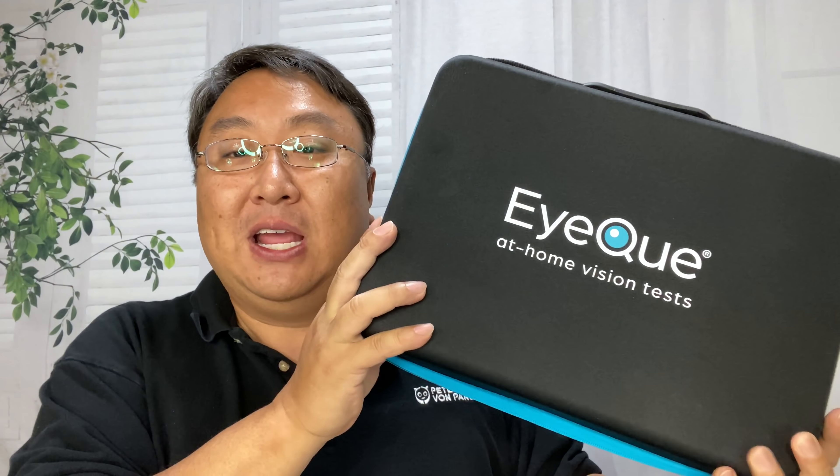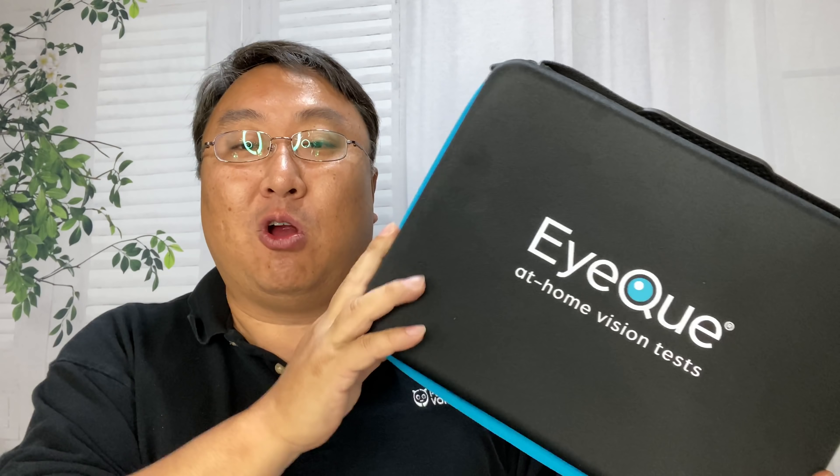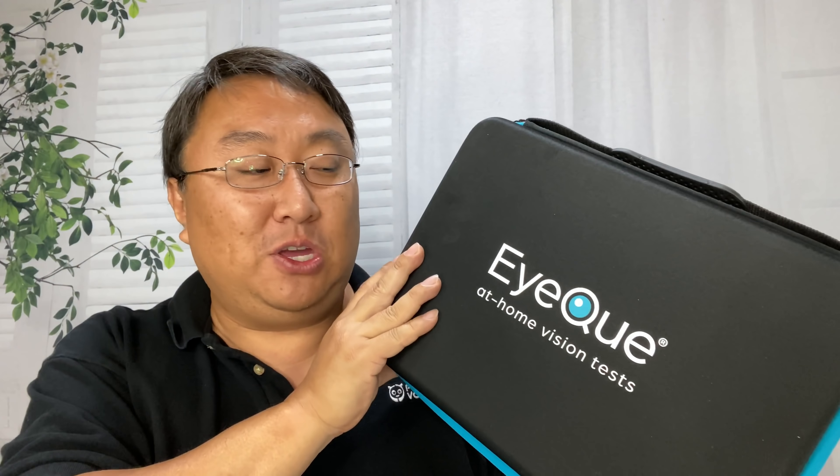No longer do I have to call and make appointments and wait around an optometrist's office and then be sold glasses in their facility. Now I can just do it whenever I feel like I might need to update my prescription — get my numbers, go online, order them, get them quickly. Not only can I get regular glasses, I can get appropriate sunglasses or recreational glasses as well. I'm just thrilled that I discovered EyeQue.